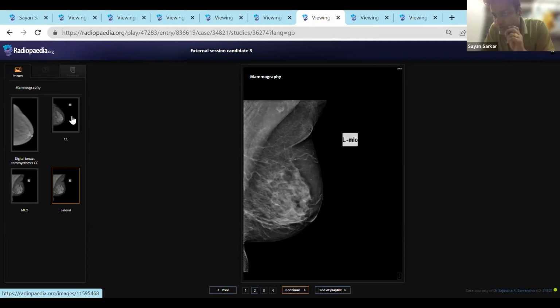What diameter are you talking about? The short axis diameter.